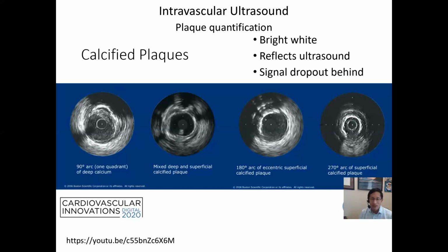It's not great. It's kind of faded. On CT, it's fantastic. You can see where the calcium is. So I'm not sure. I think I'd rather have a CT than this. Although you're in the cath lab anyway, right? When they put one of these down, it's probably another few $1,000s for your case.